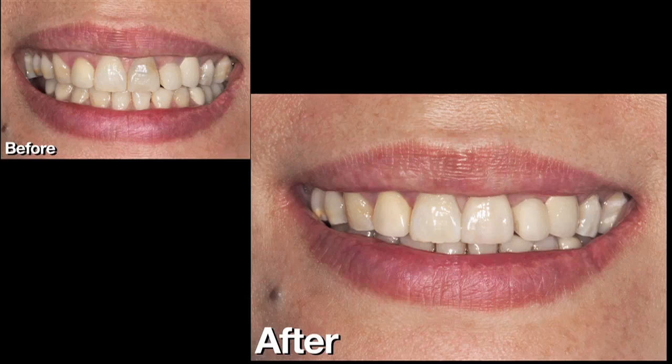and it doesn't look as good as the natural tooth next to it, but when you compare it to the PFM, and when you compare it to the all ceramic crown on the other side, neither of those are really well done, I'll give you that. And it doesn't look as good as God's crown, the natural tooth on tooth number 8. But from this very first one I put in, and this is with my in-house technician helping with some custom staining, it matches pretty well. It's not bad for something that's a chunk of zirconia with no weak porcelain to break off of it.